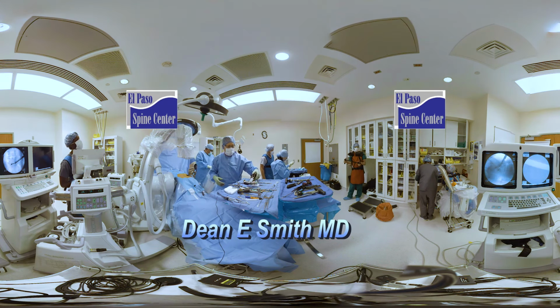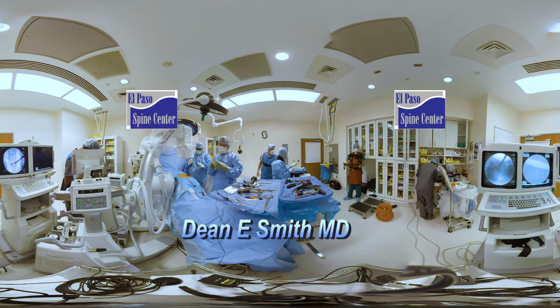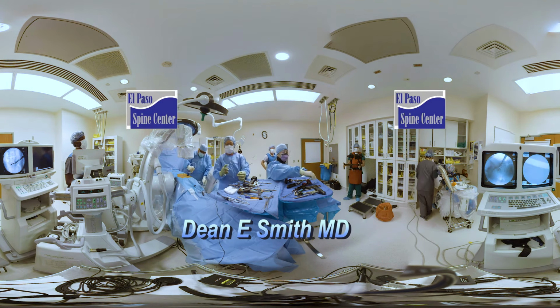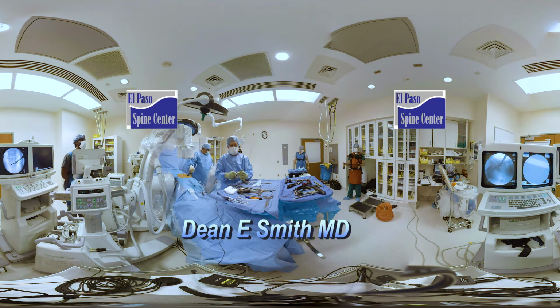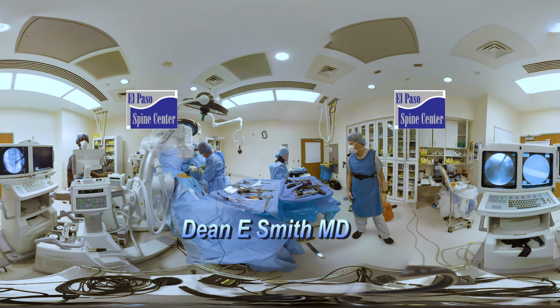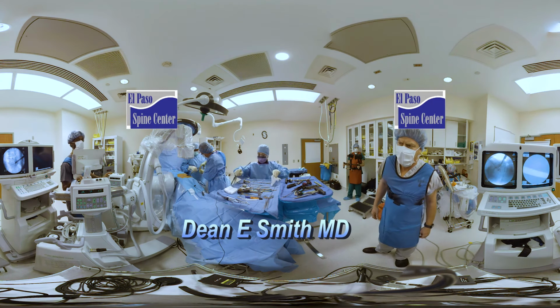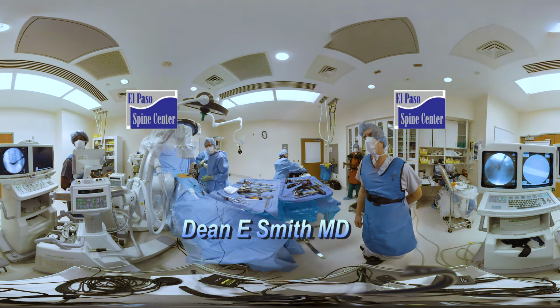Probably good, huh? Let's measure the size. I think we got a little air bubble in there. I'm going to take some of that out. AP, please. And let's see what we got. So that's 1, 2, 3, 4. AP, lateral. That's 4 right there. Yeah, let's overstuff the 5.